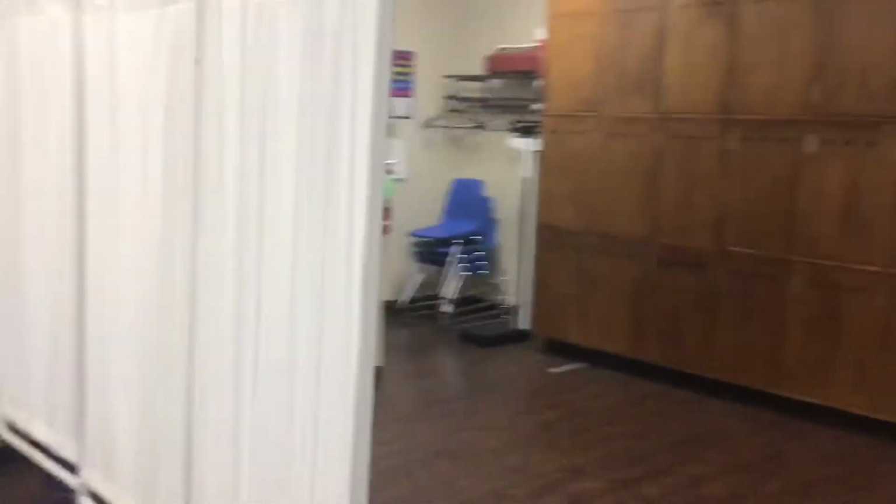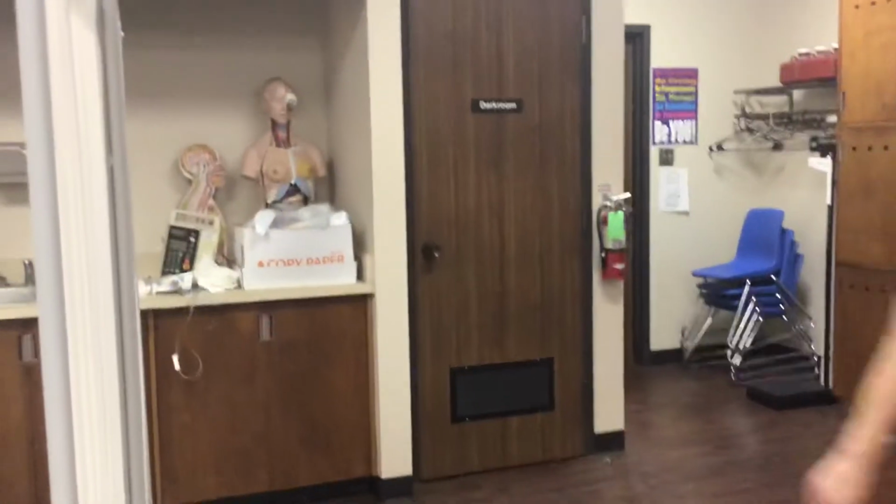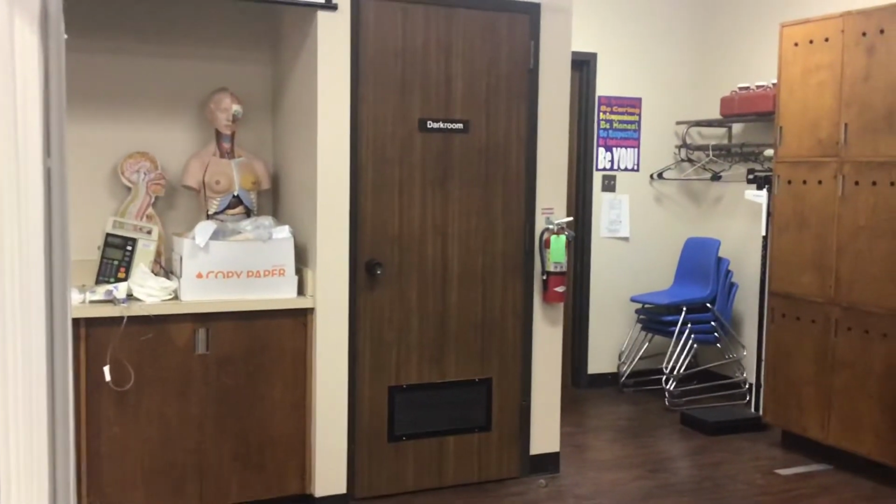Scanning the room, doing a 360 view. And I'm going to come over here. You're okay.